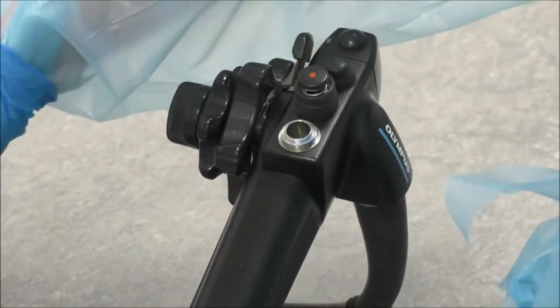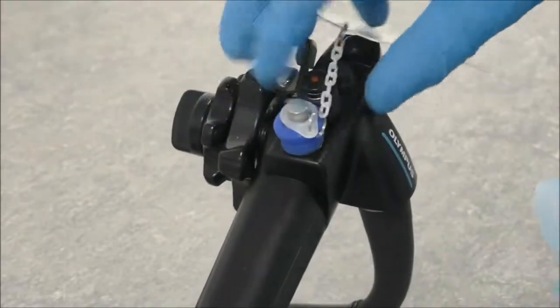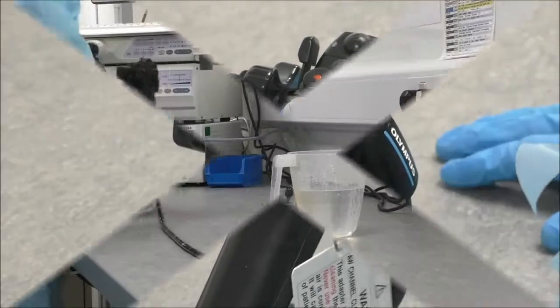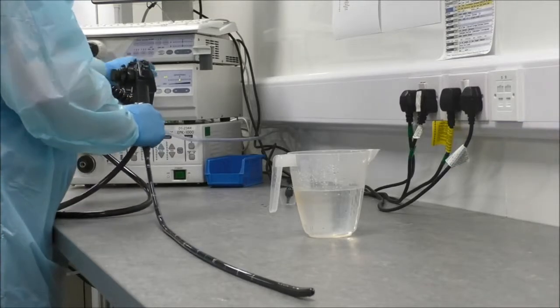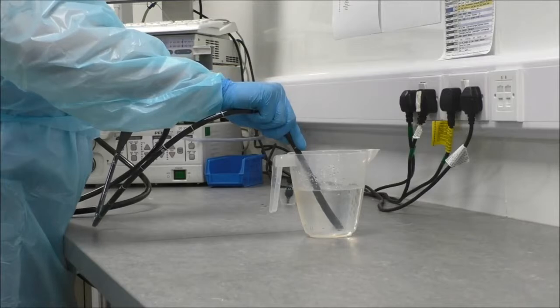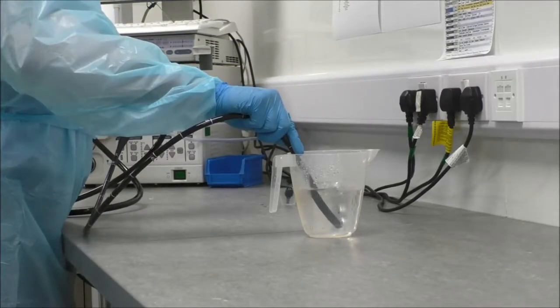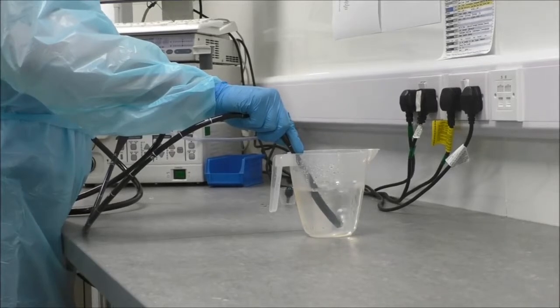The next step is to replace your used air water button for your air water cleaning adapter. Turn on the airflow, press the adapter, and allow detergent solution to flow through the scope for 30 seconds. Then release the adapter and allow air to pass through the channel for 10 seconds.